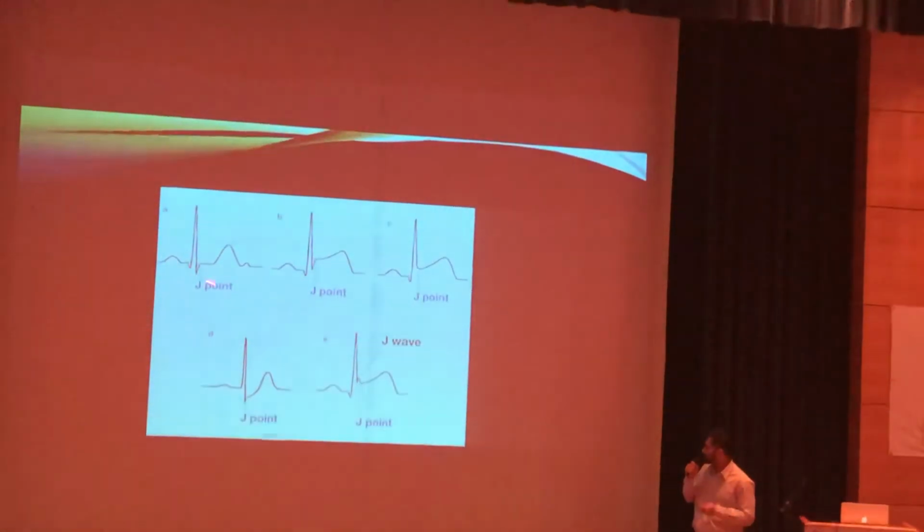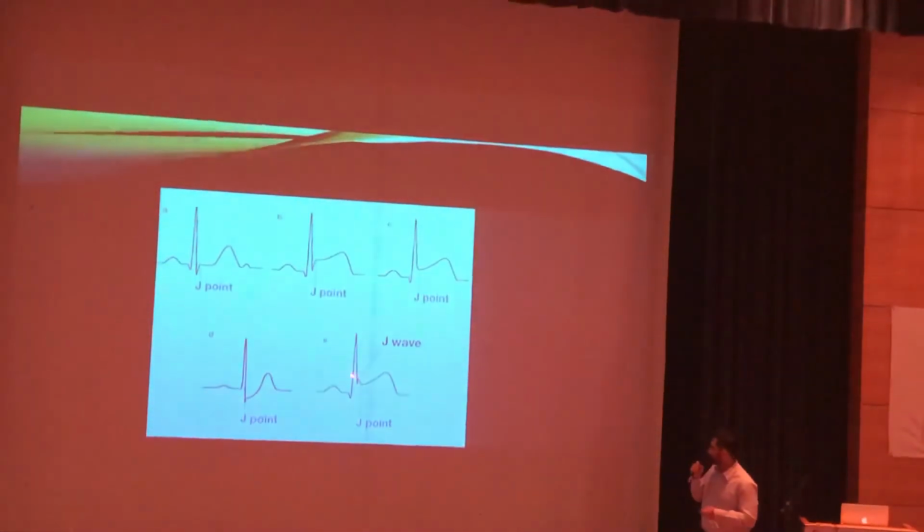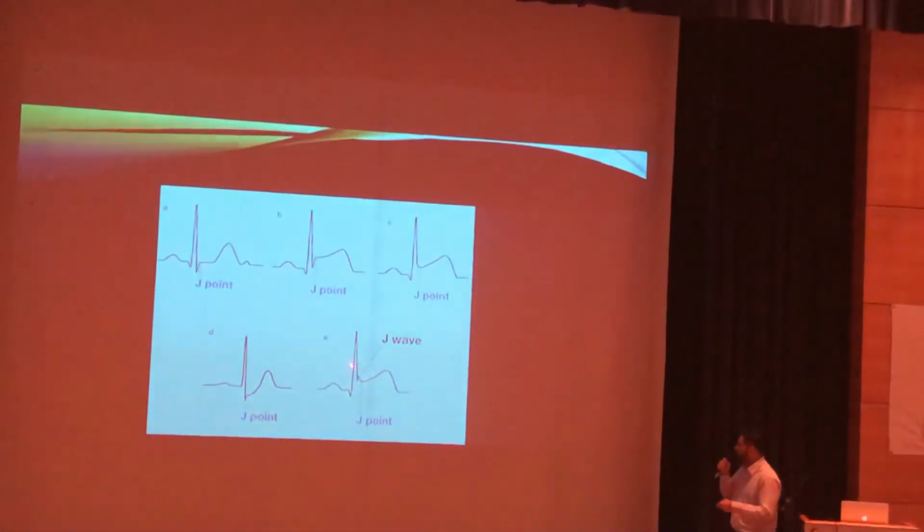I've been mentioning J point, J point, J point. So this is your J wave that I'm speaking about. This is your J wave.